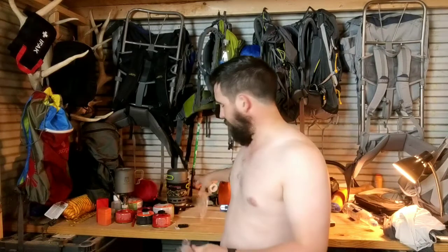Next, you're going to take your sandwich bag. You can either rip it in half, or you can leave it completely together. Whatever you want to do. I'm going to rip it in half just because, I feel like it. It's going to make it a little bit easier for me to do, all right? So first thing we're going to do, rip our bag. Now this leaves me with three clean sides and one kind of rough side.